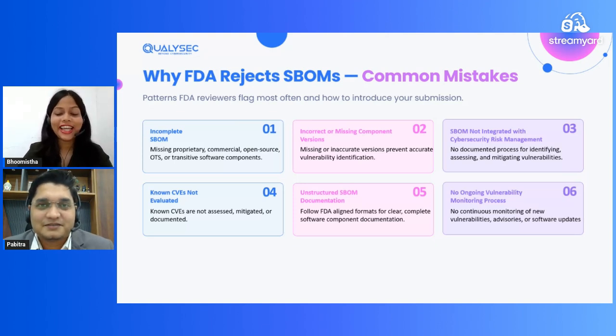One thing that really stands out here is that many FDA submission delays aren't caused by the device itself, but by incomplete cybersecurity documentation. And creating an SBOM is certainly very important, but ensuring that it's complete, accurate, and maintained throughout the product lifecycle is what truly makes the difference. Beyond regulatory compliance, it's also a cybersecurity best practice that helps organizations stay ahead of emerging vulnerabilities and software supply chain risk. I truly agree with you, sir.